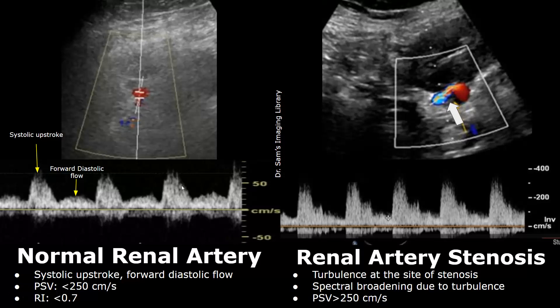Here is a case of renal artery stenosis. We will find turbulence at the site of stenosis, which will cause spectral broadening in the waveform. The peak systolic velocity will be greater than 250 centimeters per second.